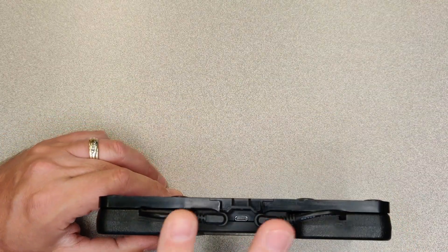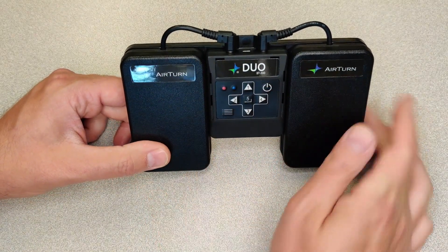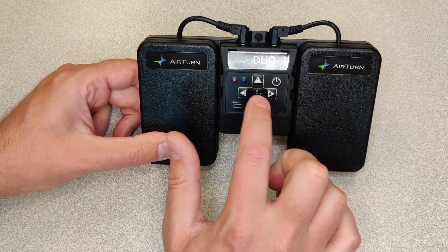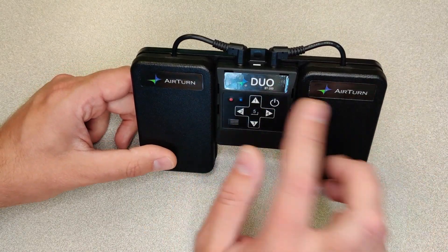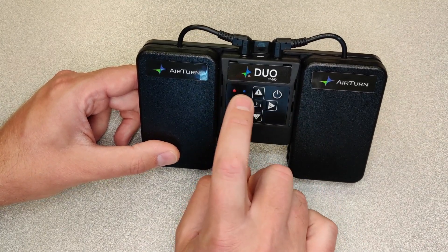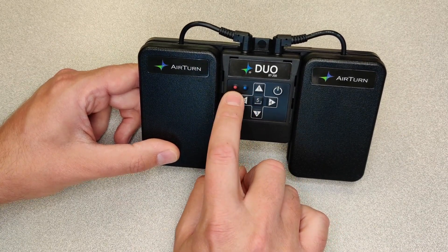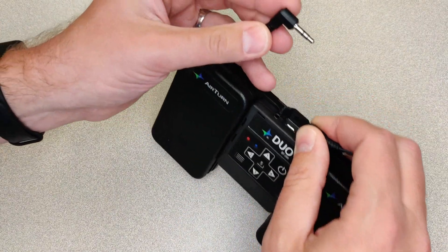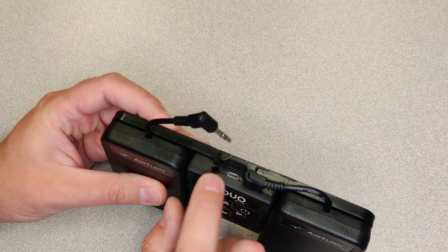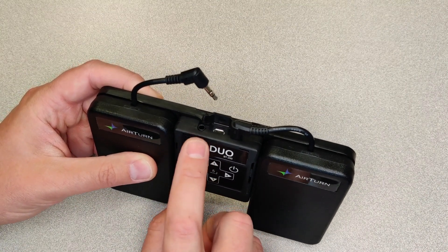One thing that came to mind was these two little inputs on the top — what they do is turn these into switches. On the front we have one, two, three, four, and five. So really this thing is a five-button switch with an on/off, a mode selector, a blue indicator for Bluetooth showing whether it's synced or not, and a power light that blinks. When we unplug the foot pedals, we see they're like a stereo plug, meaning each port has two different poles to it — literally two different switches you could have in each port.